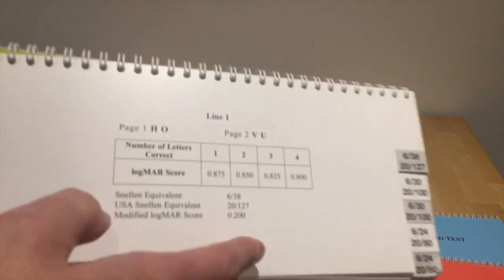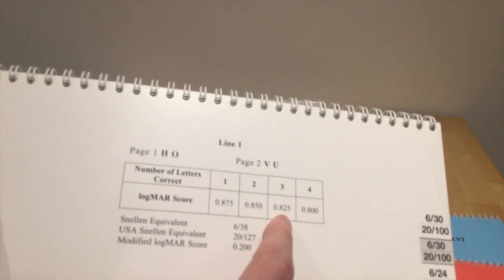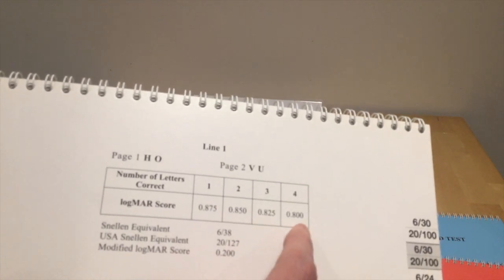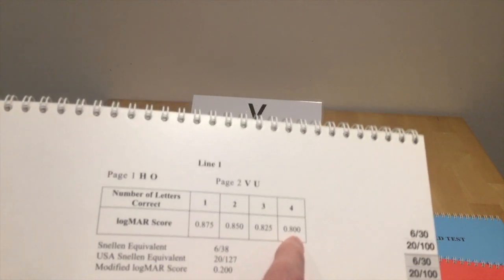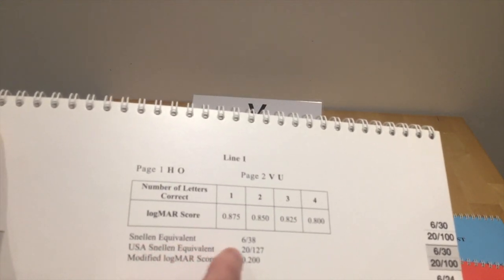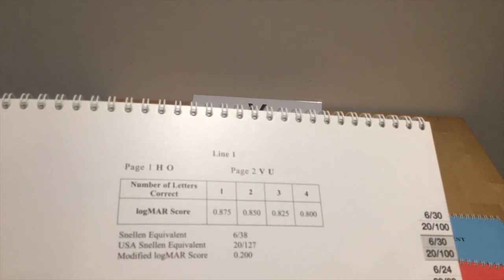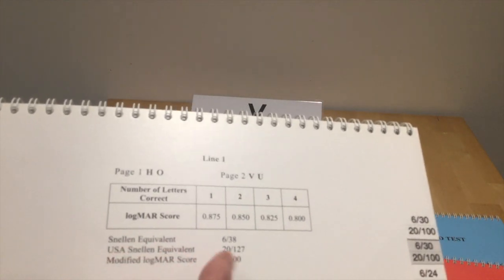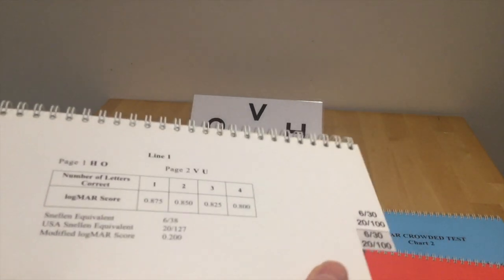We don't know about 3 and 4 because we haven't done it yet, but if we flip it over, we've got page 2 and V and U, that's correct. So if they get 3 letters correct, it's 0.825. If they get 4 correct, it's 0.8. The Snellen equivalent is 6/38. And in US Snellen equivalent, it's just the same, but it's in feet.